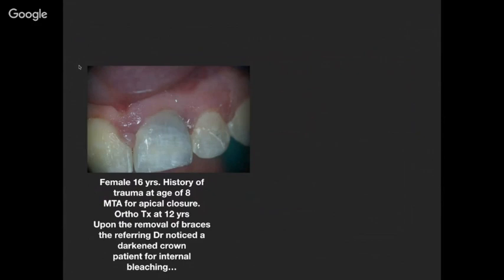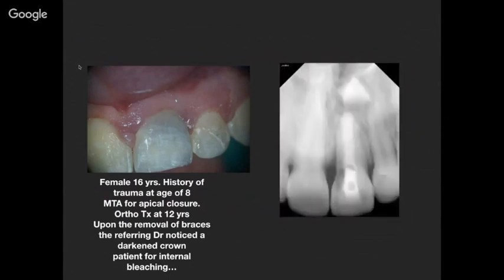In fact, I wanted to explore the situation more and more, and I asked for a CBCT to explore the whole process, because on the PA, I could see that there was a kind of lesion. There is a big extrusion of the MTA outside of the canal, and I noticed also a kind of perforation or resorption in the coronal aspect of the tooth to the mesial.